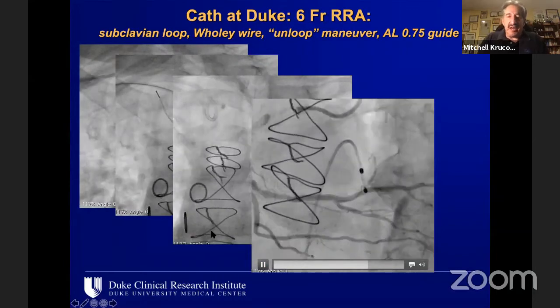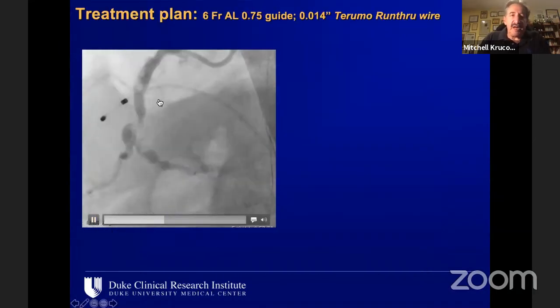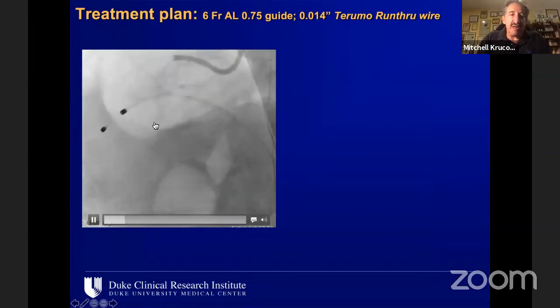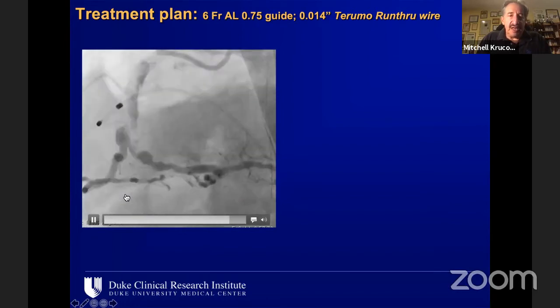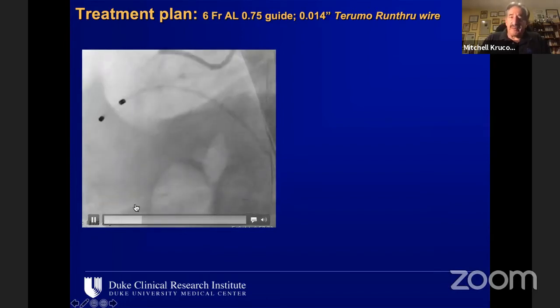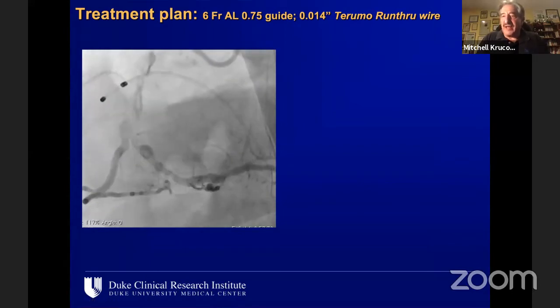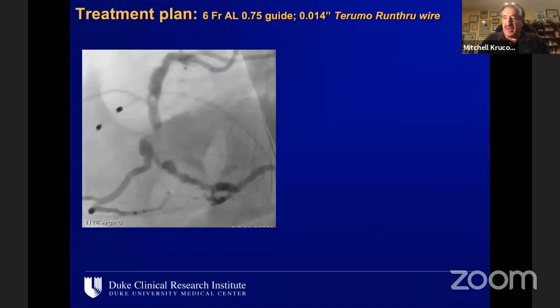And I'll show you now, this is a 90-degree left lateral picture of the right coronary. You can see the shadowing, you can see the calcium intrusion here. You can see the angulation of the lesion right here. And I just want to make the point that with that severe angulation and any sort of atherectomy device, concerns about perforation are very real.